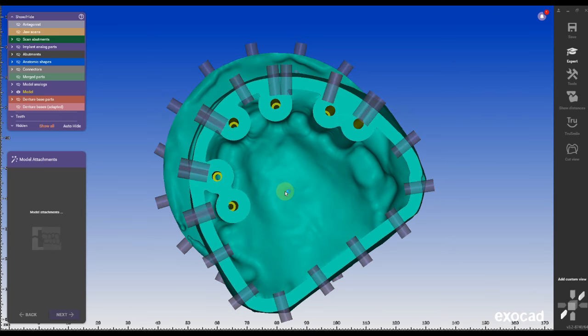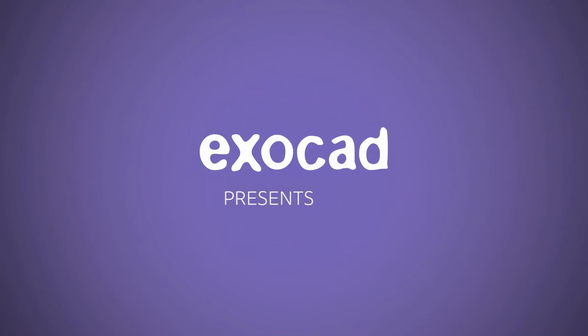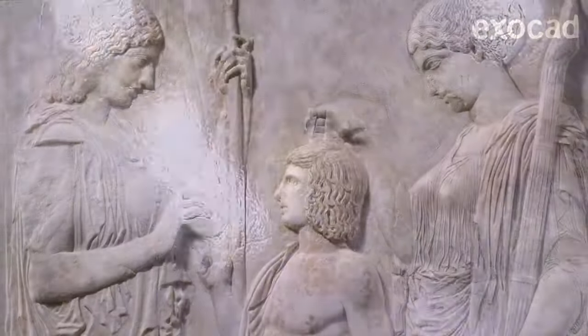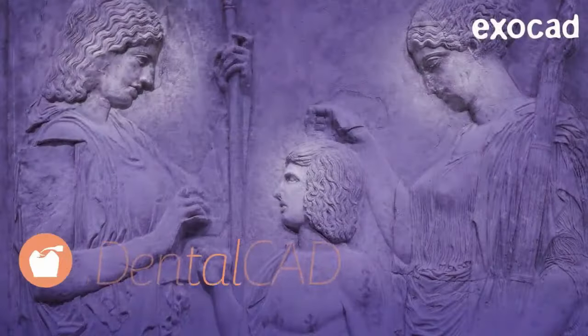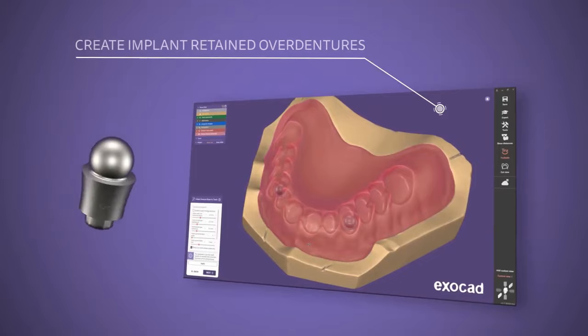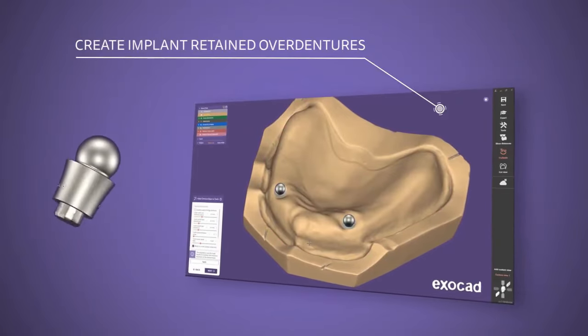Exocad 3.2 out of Sina has an amazing new feature that lets you incorporate locator attachment in your denture workflow.